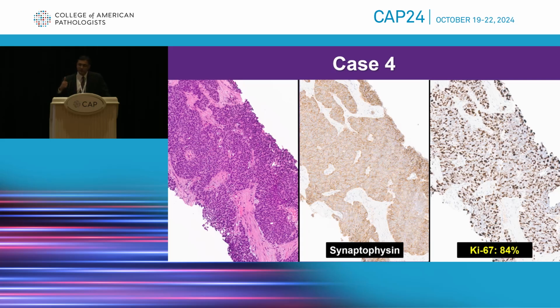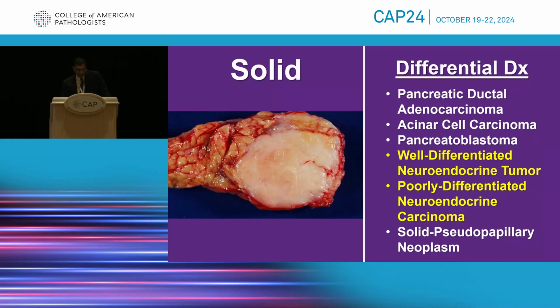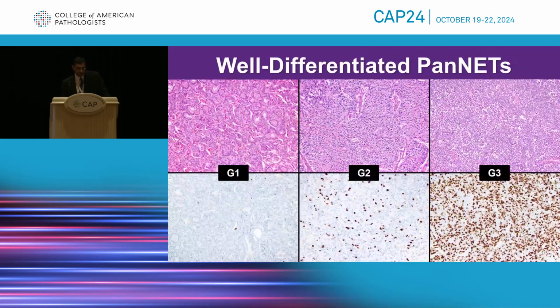Now, other markers were done, and really, again, I'm trying to hone in on the fact that we're doing panel testing, and that's BCL10, trypsin, GATA4 itself with CPA1, all negative, along with LEF1 and beta-catenin. And basically, that really whittles down our differential diagnosis to an endocrine neoplasm of the pancreas, specifically either a well-differentiated neuroendocrine tumor like a G3 or a poorly differentiated pancreatic neuroendocrine carcinoma.